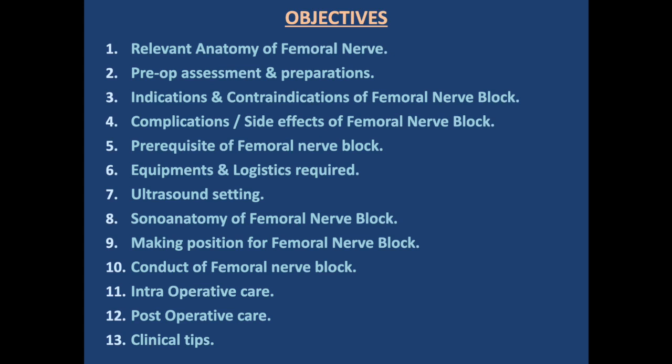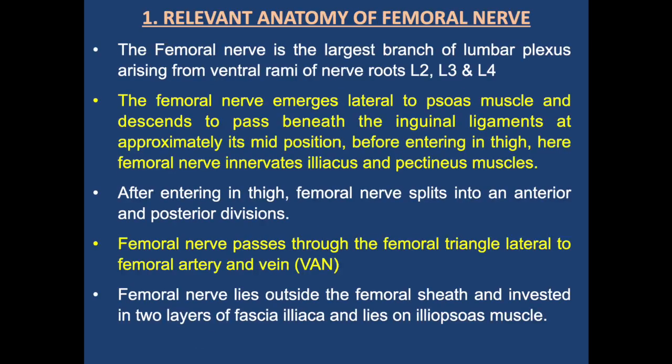We will discuss sonoanatomy of femoral nerve. We will discuss how to make position for femoral nerve block. We will discuss conduct of femoral nerve block, intraoperative care, postoperative care, and clinical tips. Relevant anatomy of femoral nerve.